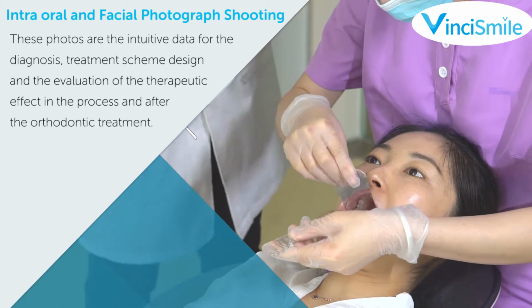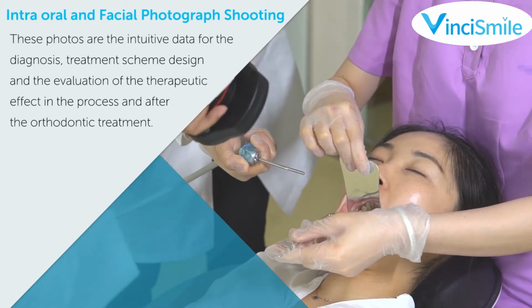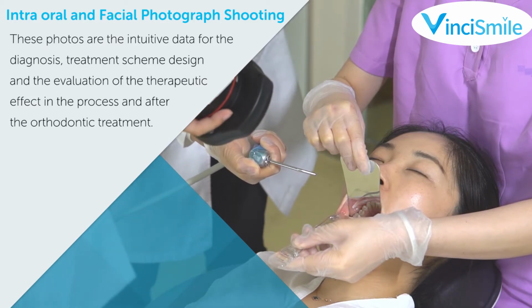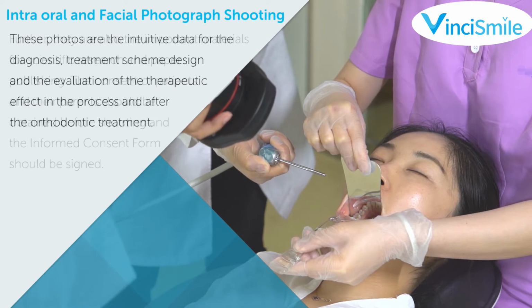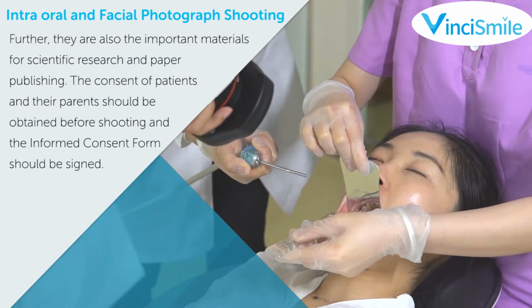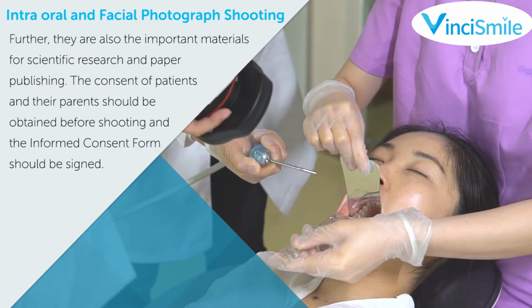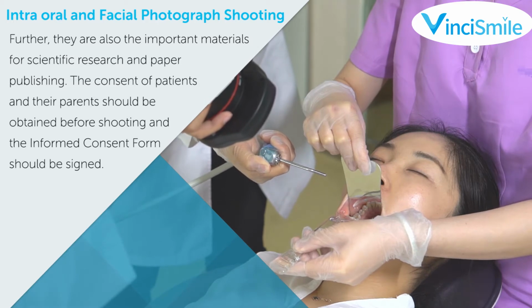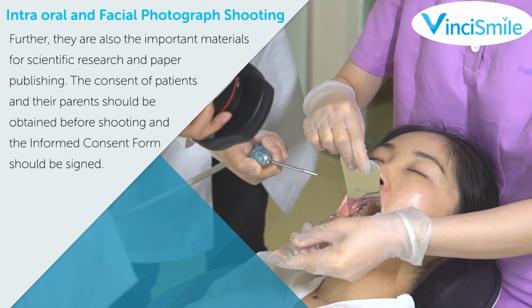These photos are the intuitive data for the diagnosis, treatment design, and the evaluation of the therapeutic effect in the process and after the orthodontic treatment. Further, they are also the important materials for scientific research and paper publishing. The consent of patients and their parents should be obtained before shooting, and the informed consent form should be signed.